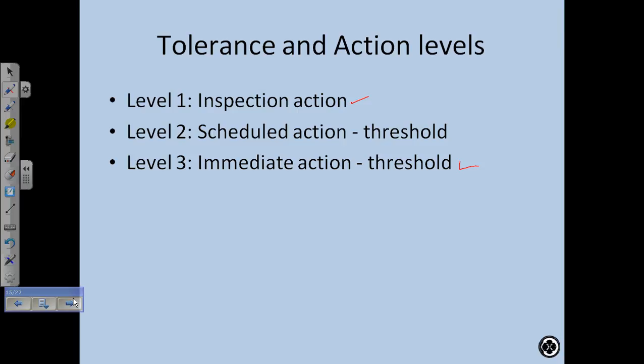So you should probably call the manufacturer and say, I need you to come in here and adjust this. Now, 5% for symmetry might not be the end of the world, so you might be able to get away for a day or two with the manufacturer coming in. Sometimes they can't come in right away. I would not say that for outputs. If you're at 5% for outputs, you can actually do something yourself. Okay, you can do that. So yeah, that's a good example.